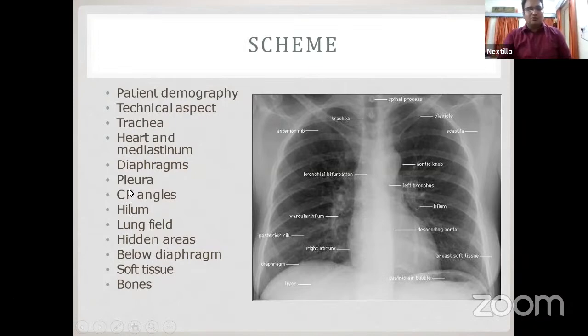Go from bones upwards. Bones, soft tissue, below the diaphragm, hidden areas, lung, hilum. Just make your own way. Okay, I'm going to look at this first, then this, then this. Okay, now let's go.